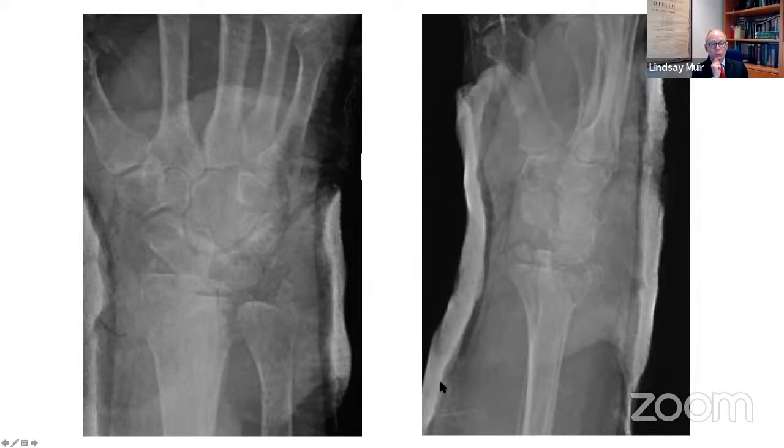And I guess they're more prone to infection, and the buried plate, the spanning plate, gives you some push down, it makes it easier to get the x-rays and you can leave it in for a longer period. But effectively, they are doing the same thing, aren't they? They are spanning across the wrist.